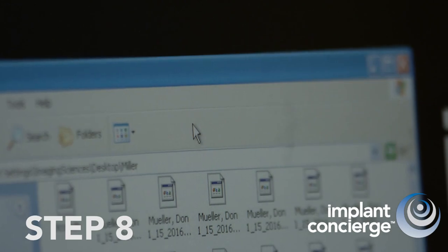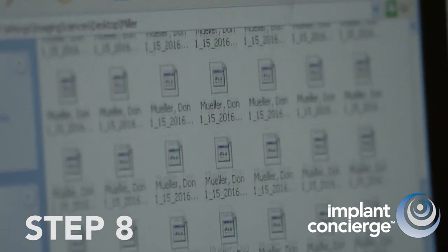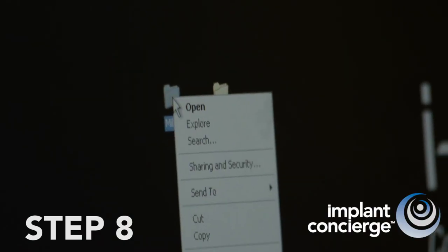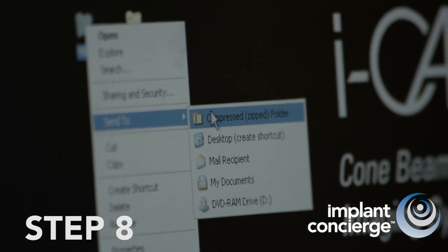Step 8. Before uploading the DICOM folders, you must first compress or zip both folders. This is very fast and easy. On your mouse, right-click the folder and select the Send To option and then select Compress or Zip.